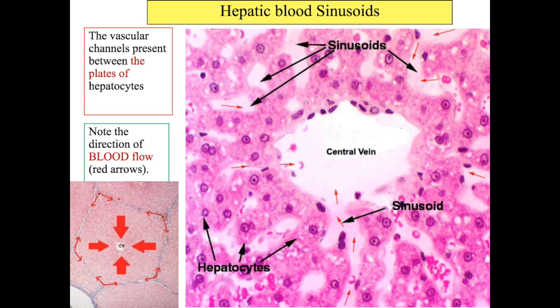Here we have the hepatocytes, and at the center, this central vein will drain the venous blood coming from the blood sinusoids after taking the oxygen and nutrients, and after exchanging the gases, where carbon dioxide is now present in this venous blood, to pass to the central vein lined by flat endothelium. Then this central vein will carry the venous blood away from this classic hepatic lobule.